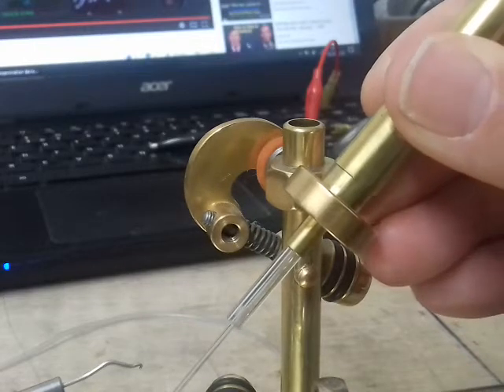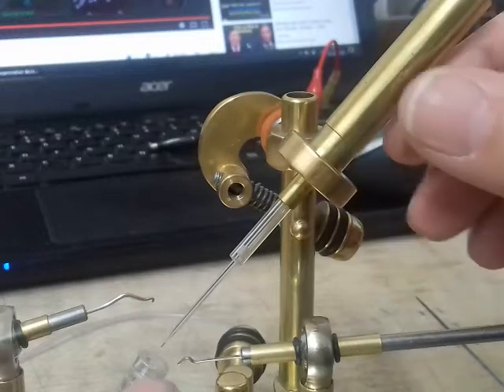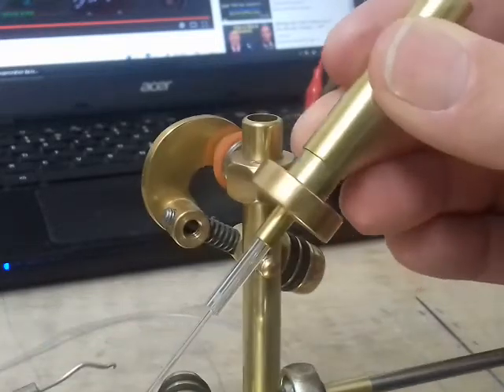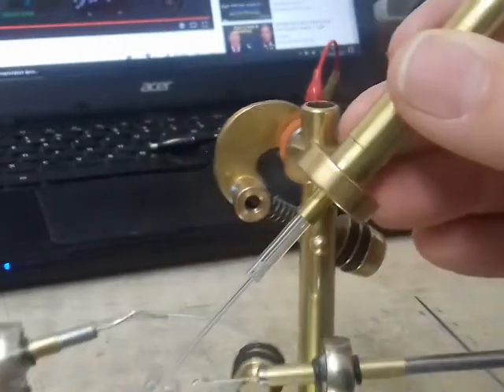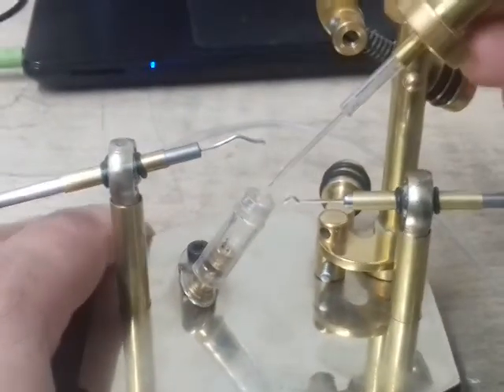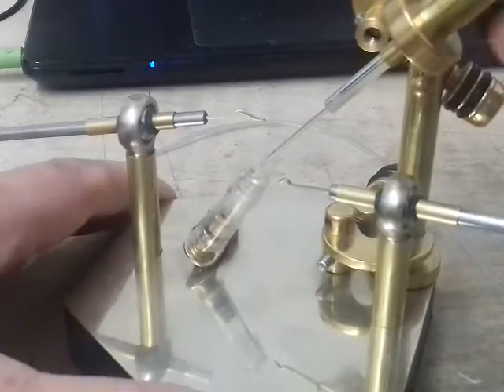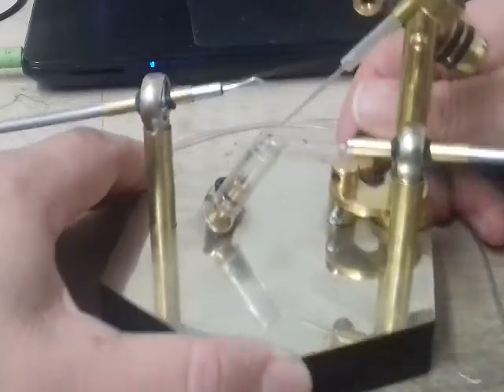And if you get a needle that's slightly not straight at the end, slightly deformed on the end, you can actually turn this and line it up that way as well. So you've got six ways really of manipulating things to get it to work, and that works really well. So that's basically it. That's the unit itself complete.